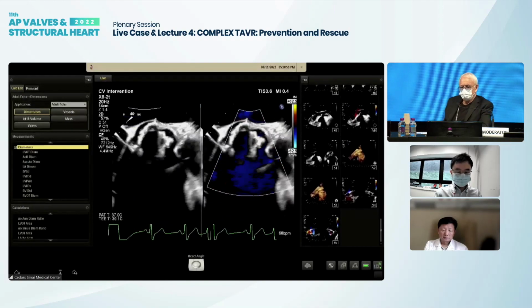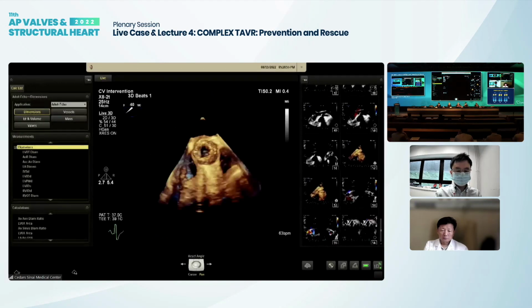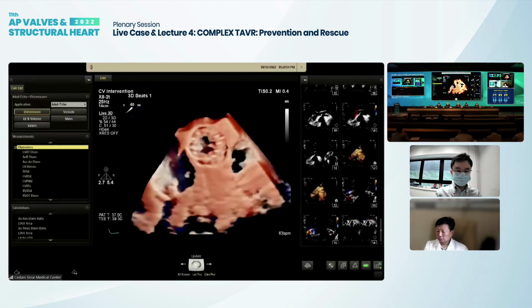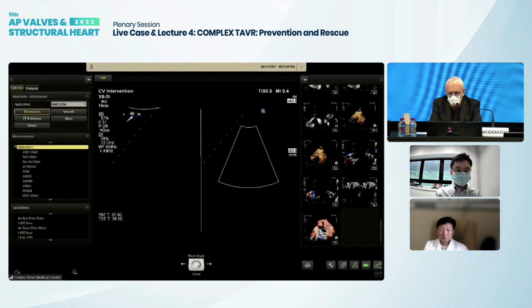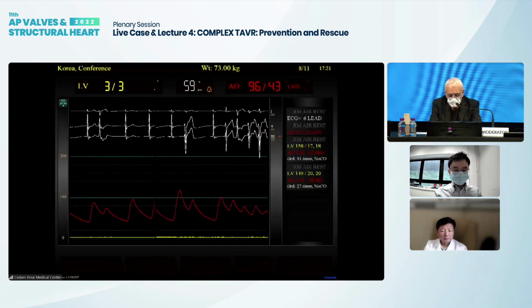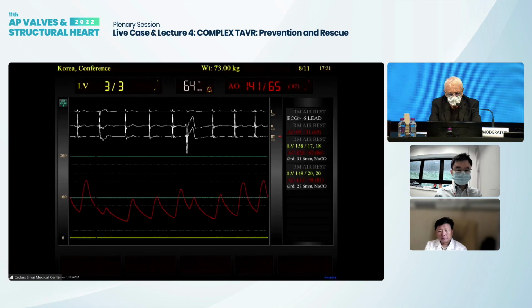So I think the key is to create the right balance here. You know what I'm saying? There's no heart block either. What's the EKG like? You can see the EKG. I think that nonetheless, we would be vigilant with this patient when the patient is in the hospital.